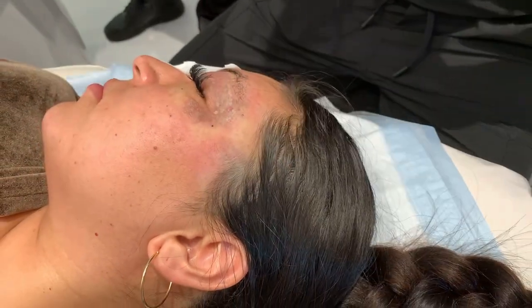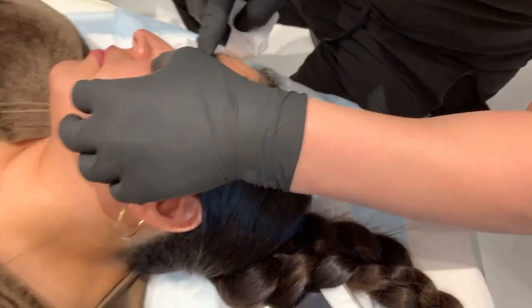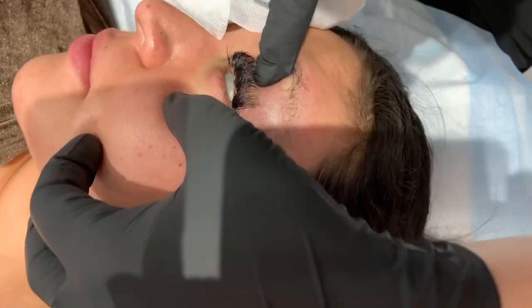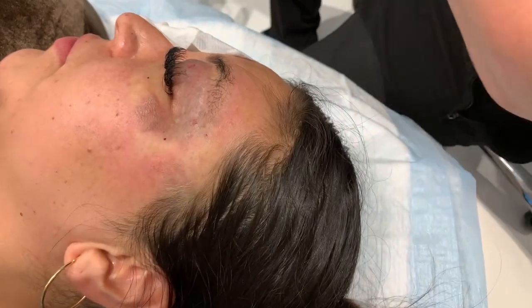Remind everyone who might be tuning in what we've done to protect her eyes. Oh yeah, so we have metal shields inside, just so you guys can see, take a look. She's like Iron Man in there, because we're protecting her eyes. So now we're gonna, again, last one.